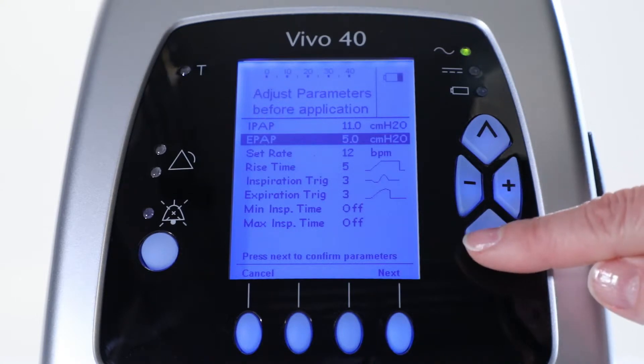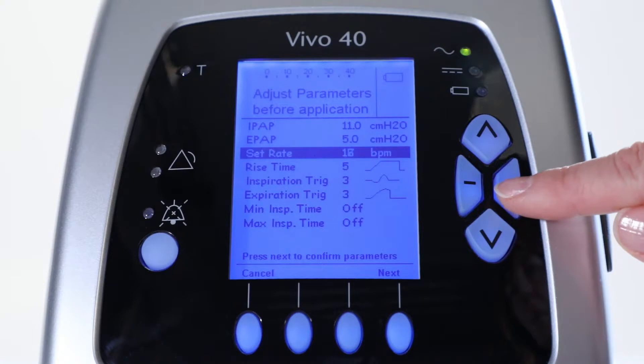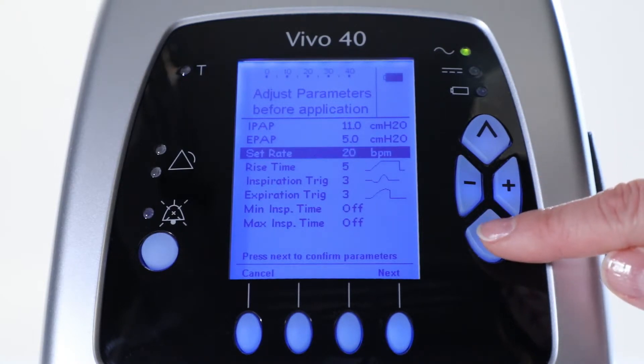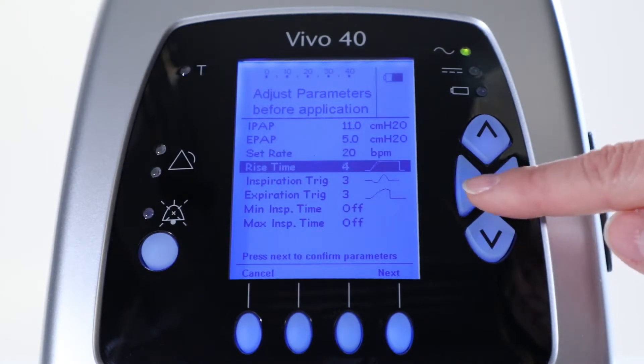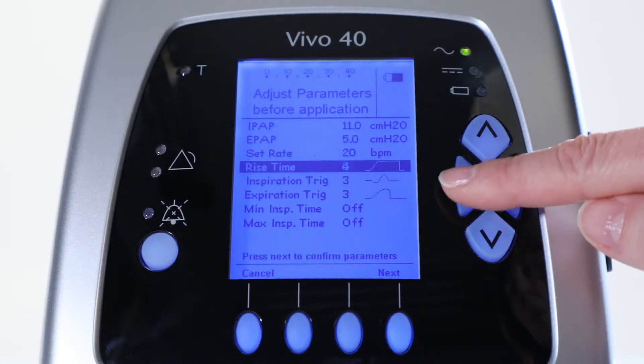Furthermore, you select the set rate and adjust it to 20 breaths per minute. Then, you select the rise time to increase the peak flow when the air is delivered to the patient. To set the fastest, choose 1.